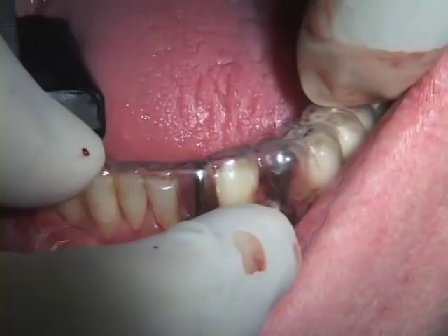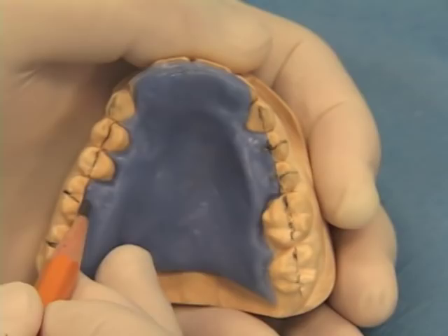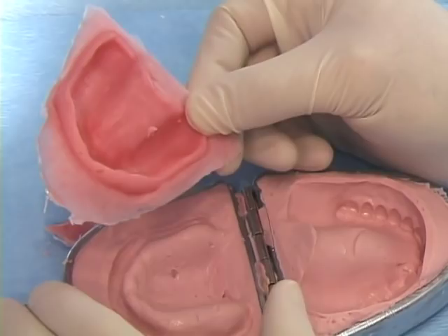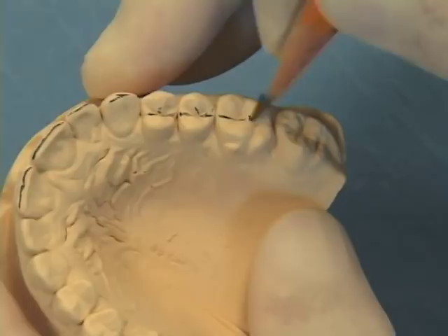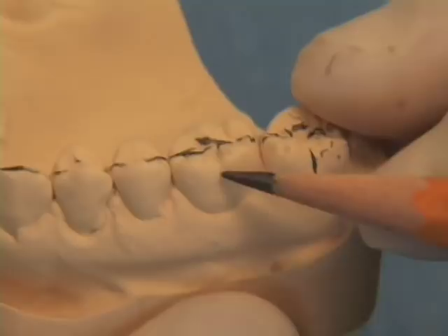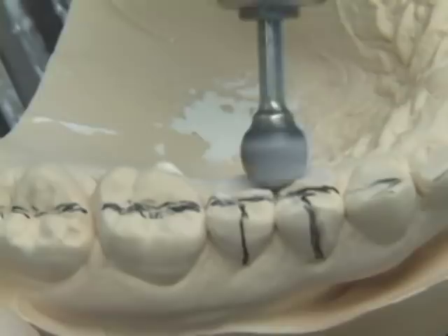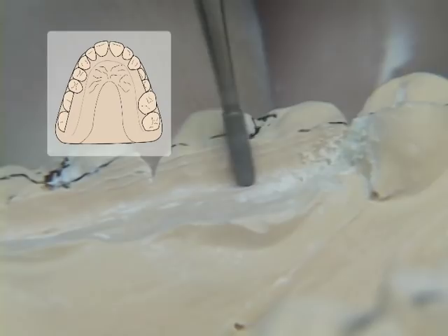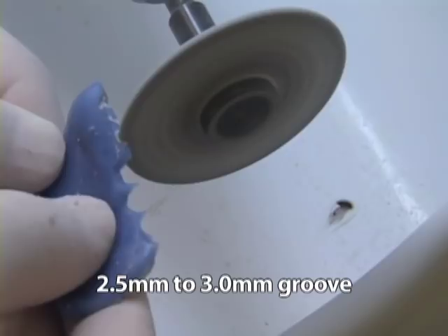Palatal templates can be fabricated on a stone model or by duplicating or using an existing removable prosthesis. When using a duplicated stone model of a diagnostic wax-up, draw a line through the incisal edge and occlusal surfaces of the teeth and another line on the facial surface through the center of each tooth to be replaced, bisecting the drawn incisal or occlusal line. Remove the stone representing the lingual half of the teeth to be replaced. Mold acrylic onto the lingual aspect of the modified model up to the level of the central fossa or incisal edge of the teeth to be restored. Cut a 2.5 to 3.0 millimeter wide groove in the acrylic corresponding to the center and long axis of each intended tooth to be replaced.